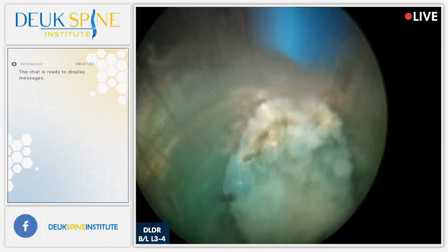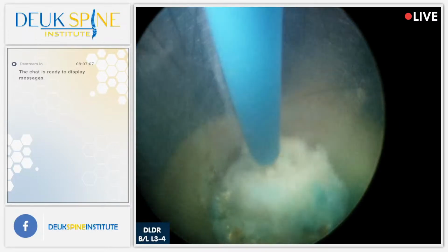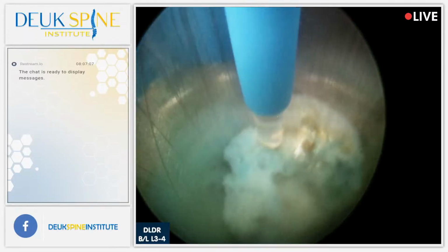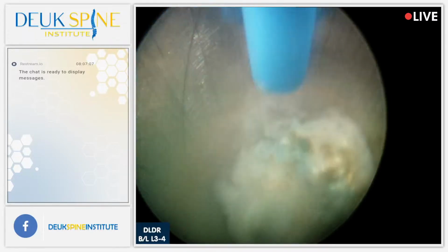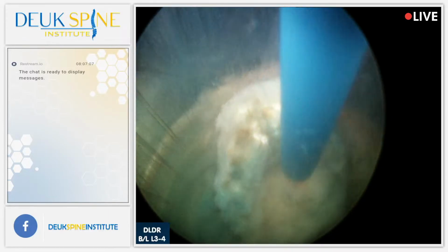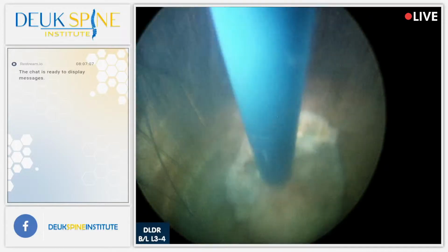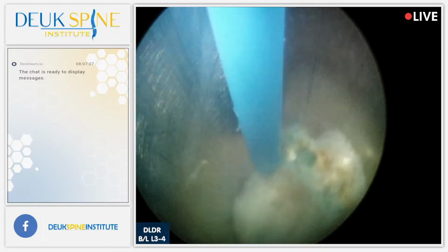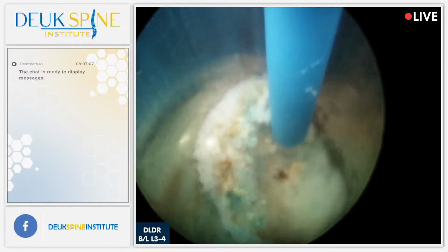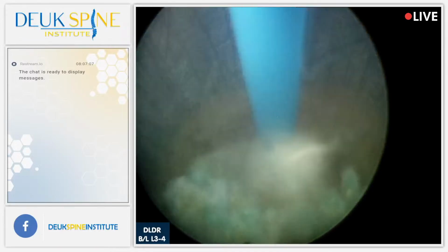Now you see the gold color, that comes from calcium. And calcium is found in damaged tissues of your body. It's called dystrophic calcification. It's something that I was taught in medical school in pathology, and it's not unique to the disc. If you have damaged tissue anywhere, your liver, your lungs, a lot of times you'll see chronic inflammation and calcification.